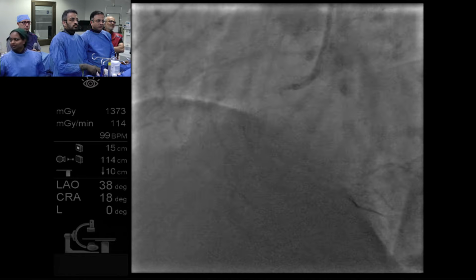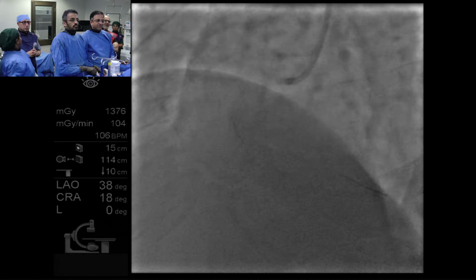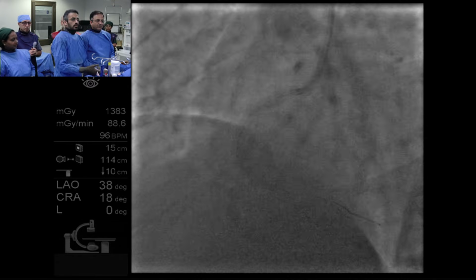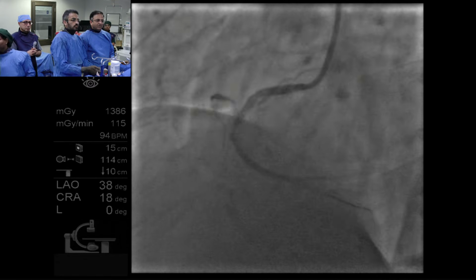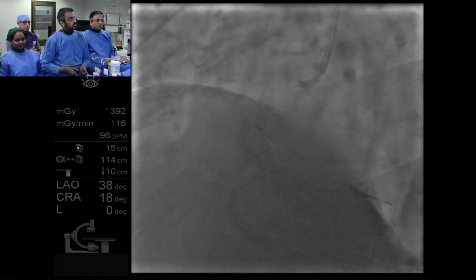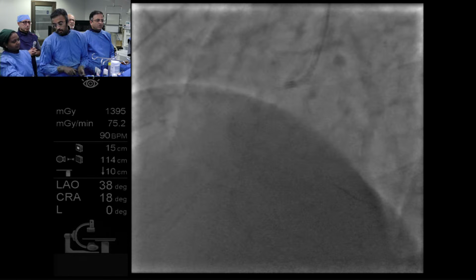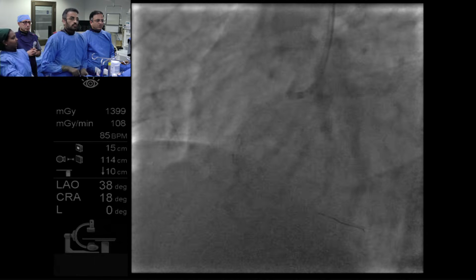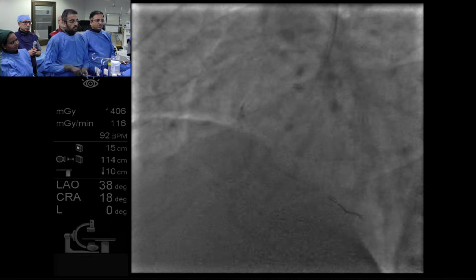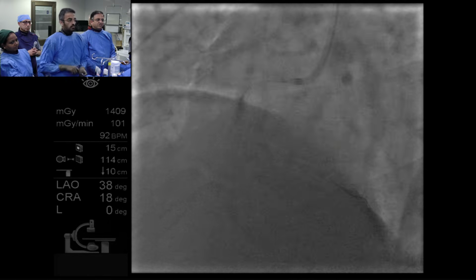I think that's good, right? Okay, let's go up there. Adrenaline is working, okay. Yeah, now let's do it here. Yeah, let's go up there. Increase the fluid a bit faster. Up to 2, right? 1. Okay, I think that's the right spot.